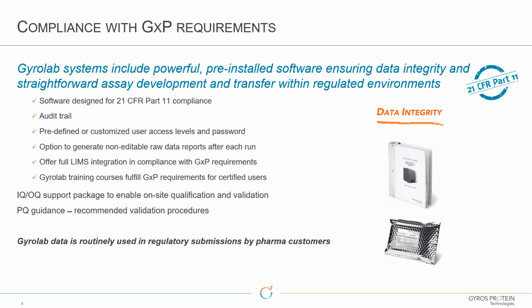Yeah. And another important thing is equipment qualifications, IQ, OQ. So when an instrument is installed, we can provide a documentation package to show all the testing that's been done, and that the instrument has been fully tested and meets manufacturer and operational specifications. And we can also give guidance on a performance qualification that they need to perform. Right. So a performance qualification test would be something like a standard method that you run to prove that the instrument is doing its thing.